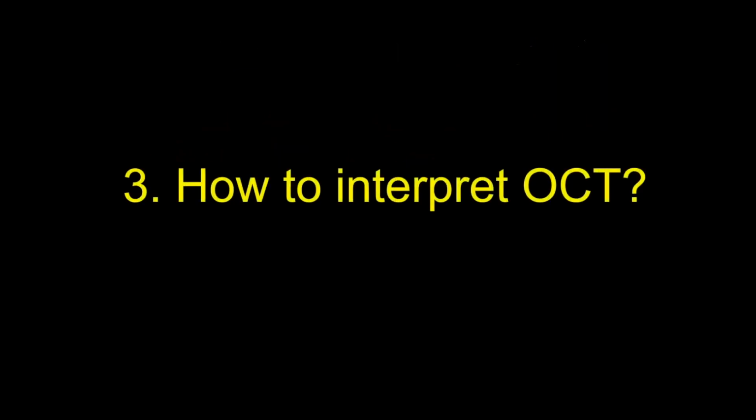If you want to look at this, this is an interesting paper from a Dutch group where, like the American stent appropriateness criteria, they have published the OCT appropriateness criteria. I think that's interesting. I will not go into the details of this.